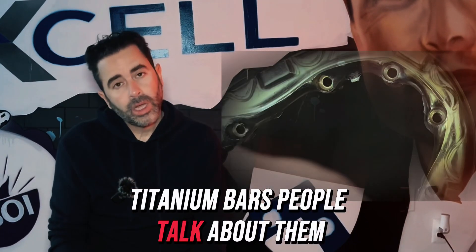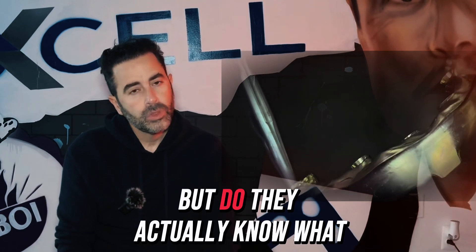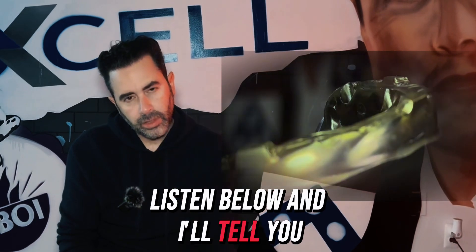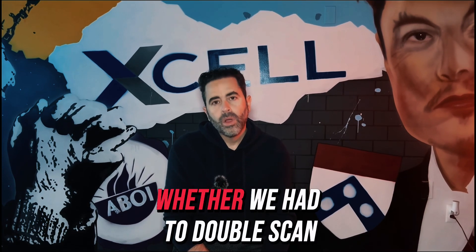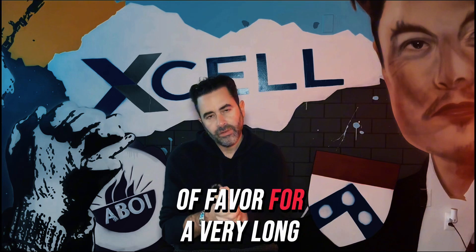Titanium bars — people talk about them, people fabricate them, but do they actually know what and how they are doing it? Titanium bars have historically always been an issue: whether we had to cast them, whether we had to mill them, whether we had to double scan them — it was always a problem, and that's why they went out of favor for a very long time.